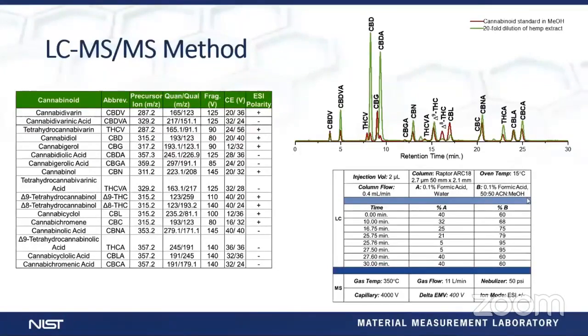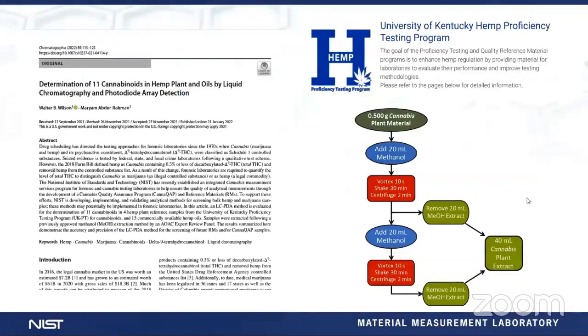Here in the top right, you can see chromatograms that show, in some cases, there is still some co-elution. That's the advantage of using the tandem mass spec. It allows you to mass spectrally separate out co-eluting isomers from each other. This method was transferred to a forensic laboratory, Maryland State Police, and with almost minimal changes to the method, it was adopted very well in their laboratory.